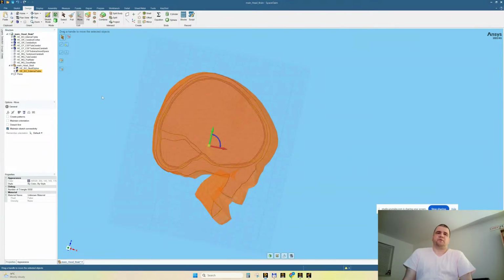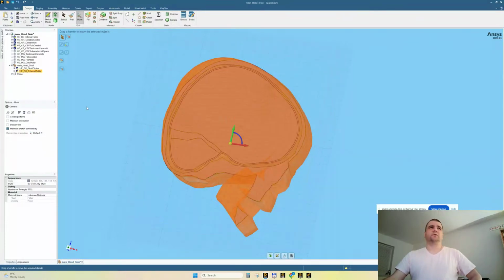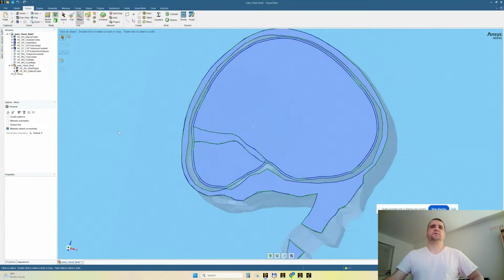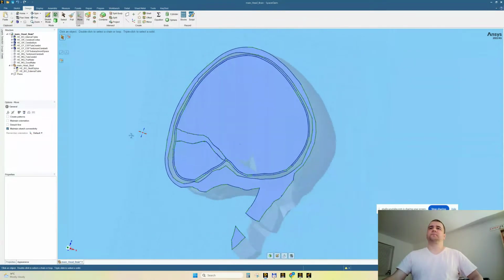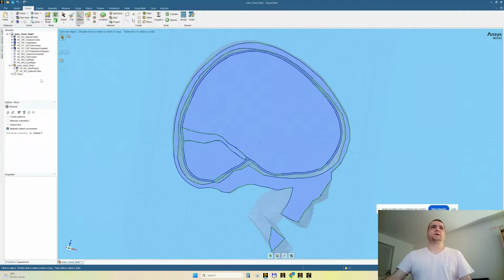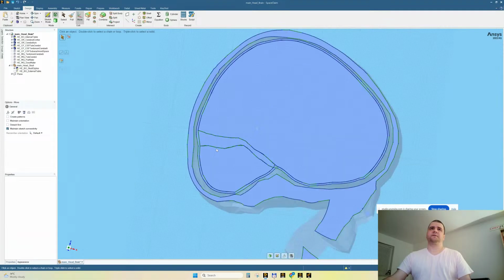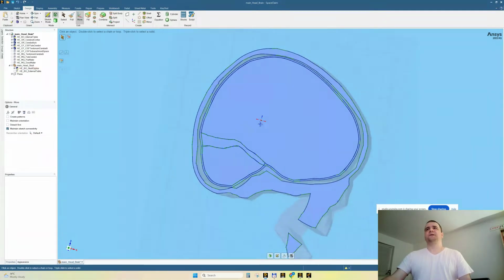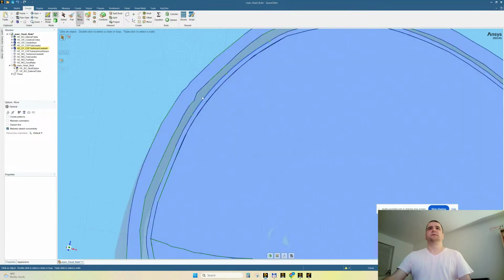And we usually, in explicit dynamics, when we're dealing with high velocity impacts and something similar, need to work only with surface bodies to save computational time. Look here, once I have hidden the open parts, the surface bodies, they begin to make sense, yes? So we have a solid here, solid here, solid here, solid here. Only one problem is that we're kind of missing a meninge, let's say. Yeah, there is too much gap here.